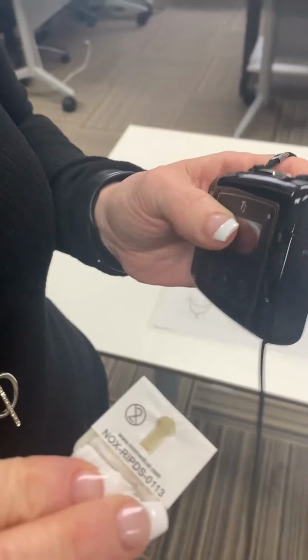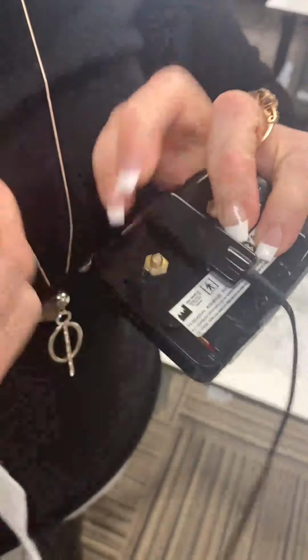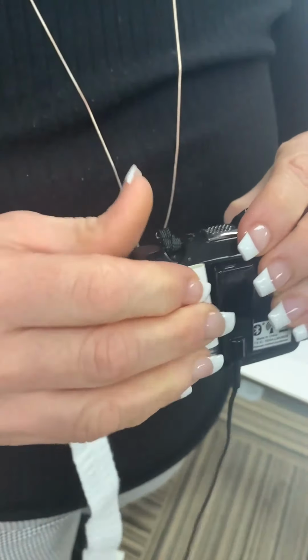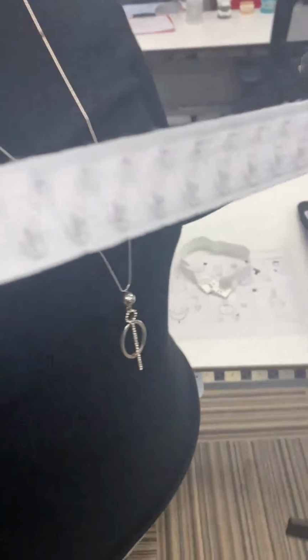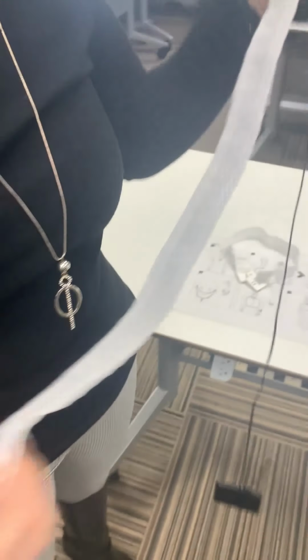There are 2 belts, one for the chest and one for the belly. There are buttons to which you will snap both belts. The wires are to be flat against your shirt or pajamas.